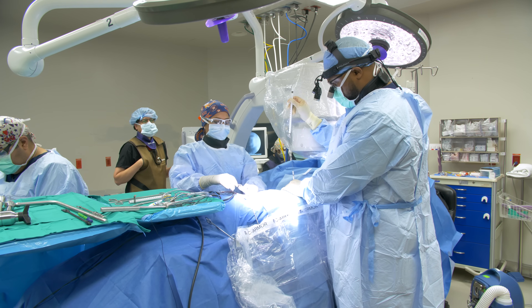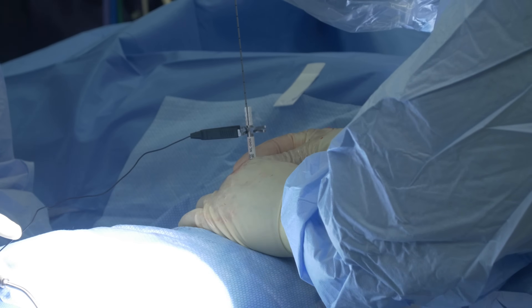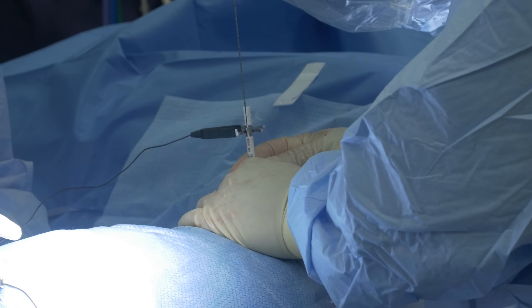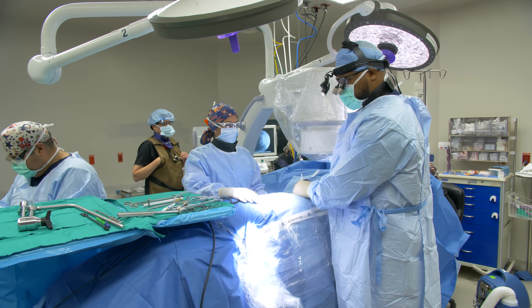We're working through sequential dilators. This small wire is going into the disc space, providing stability so nothing moves during the approach.